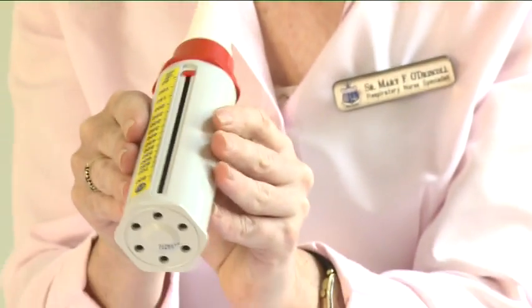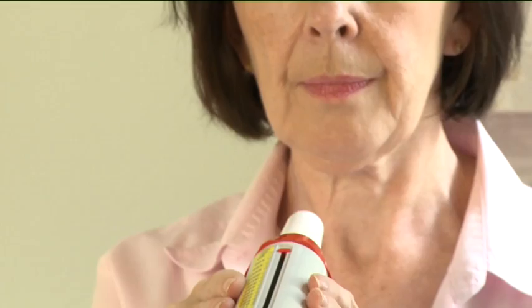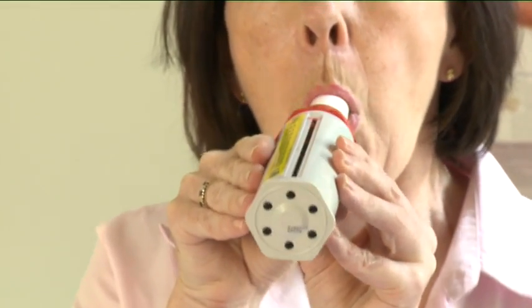Stand up if possible. Take a deep breath. Place the peak flow meter in the mouth and hold horizontally, closing the lips around the mouthpiece. Then blow as hard and as fast as you can.